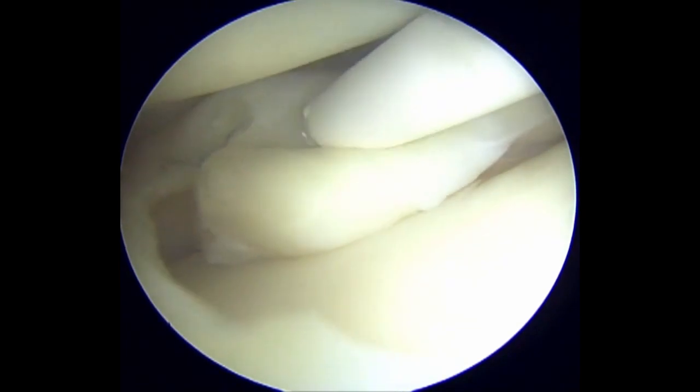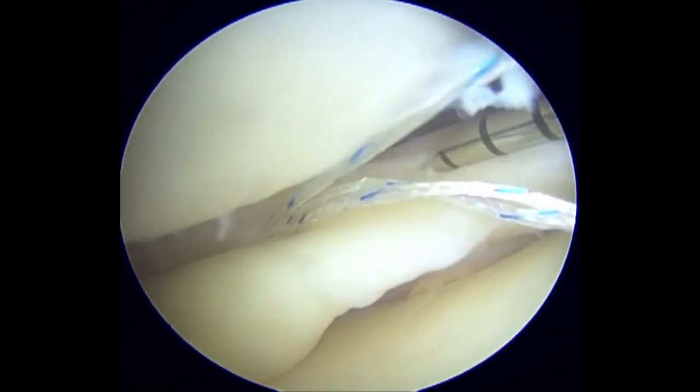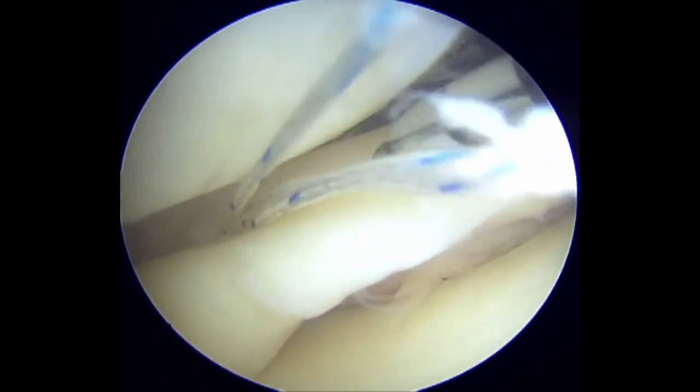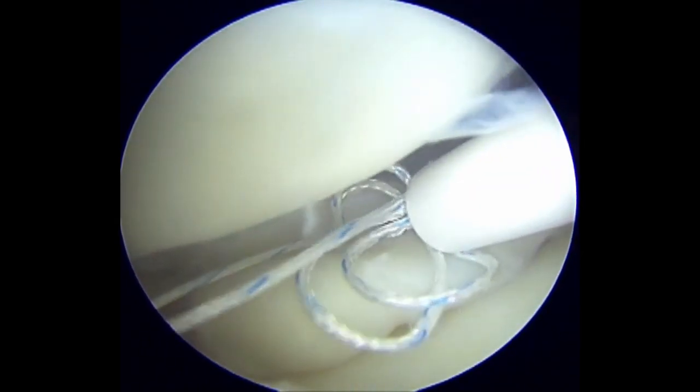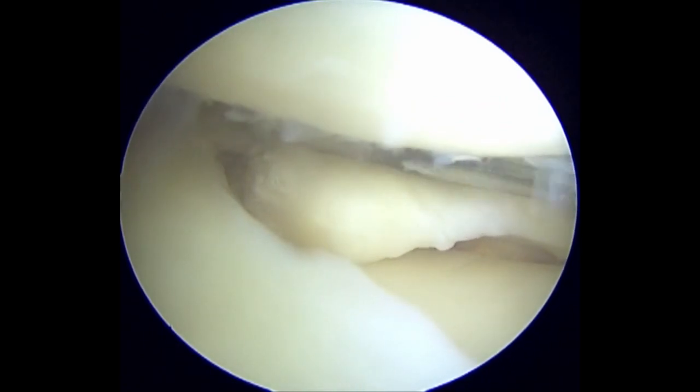A horizontal rib stop stitch into the capsule is then placed at the superior surface of the posterior horn of the lateral meniscus. This helps to prevent the flap from re-displacing into the recess.